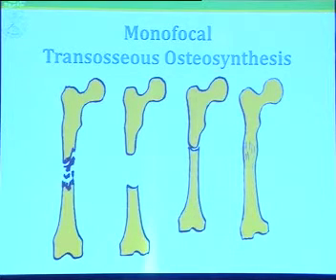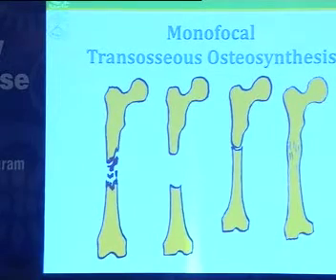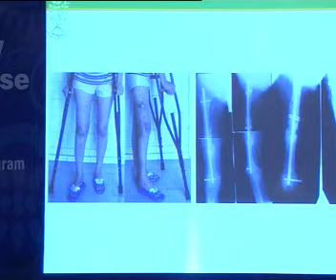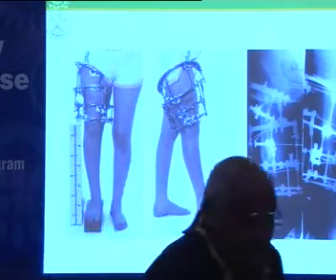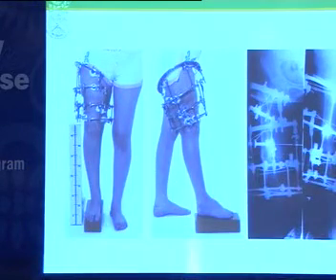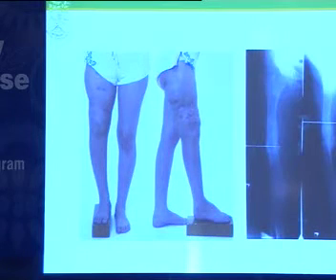The scheme of the monofocal transosseous osteosynthesis. Patient's diagnosis: pseudarthrosis of the femur, intramedullary locking nail, osteomyelitis, 5 cm shortening. Fistulography, sequestral necrectomy, fragment adaptation, open adaptation, and fixation using the Ilizarov apparatus. Short-term follow-up: fistula closed, integrity of the bone was restored.